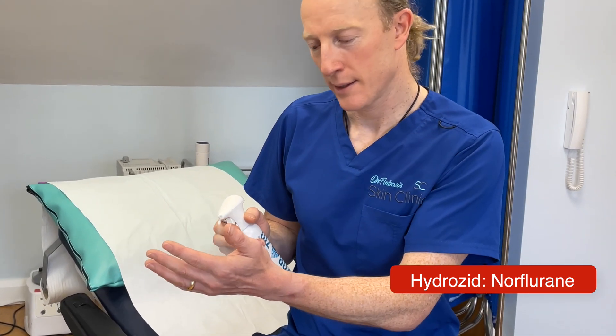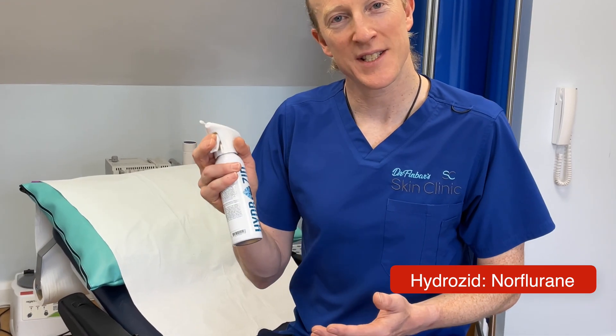This cold blast destroys the affected tissue by freezing the intracellular fluid, forming ice shards and crystals, and this ruptures the cell membrane, destroying the cell.